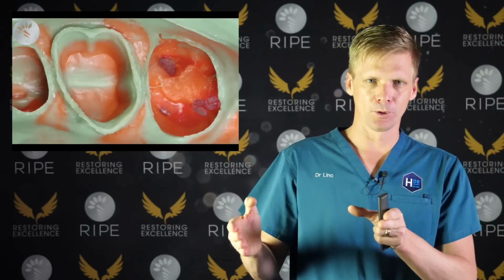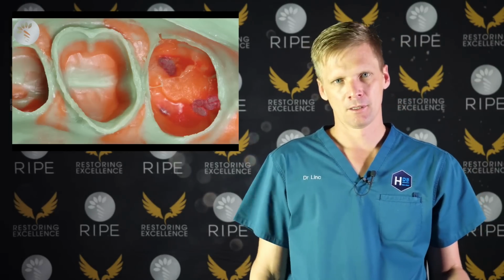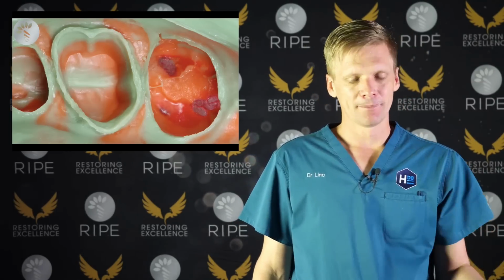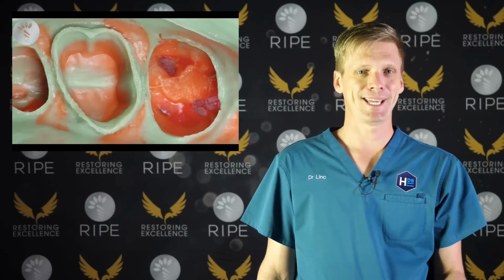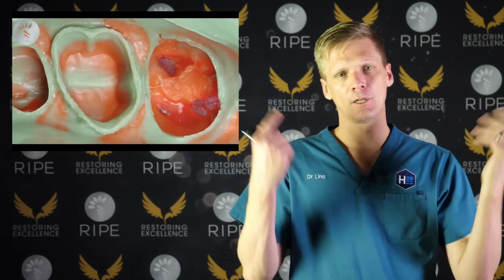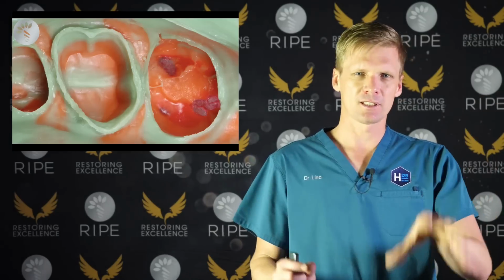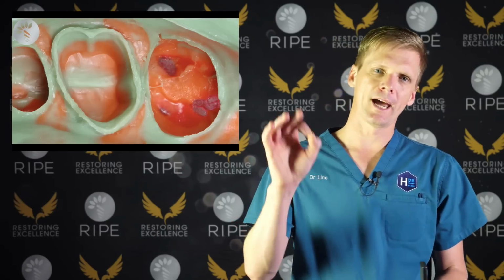And then most importantly, you wait at least 5 minutes. So you wait 5 minutes. If it was a bloodbath, then wait 10. Because there's no point pulling it. If you pull it out sooner, it will just collapse and then it will bleed. So just leave it in. If you leave thick cord soaked in viscostat for 10 minutes, it doesn't matter how much it was bleeding beforehand, you can pull it out and it won't bleed.